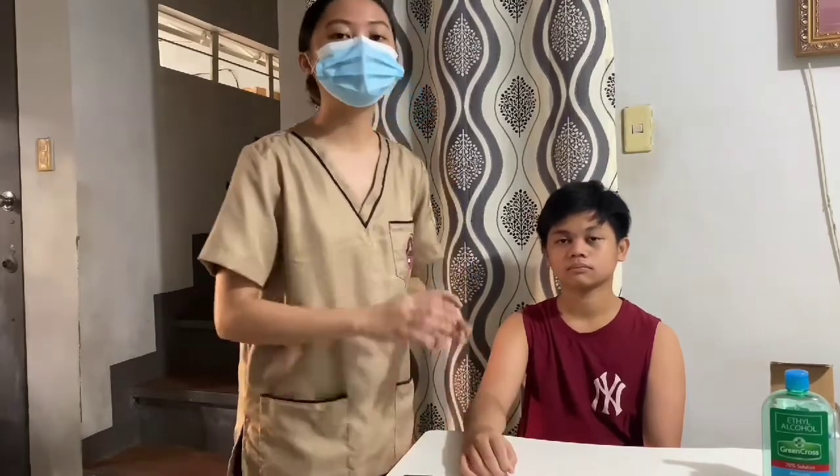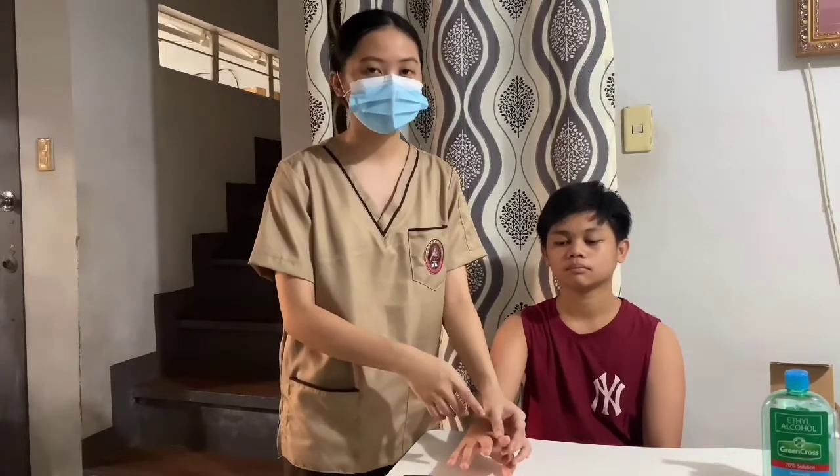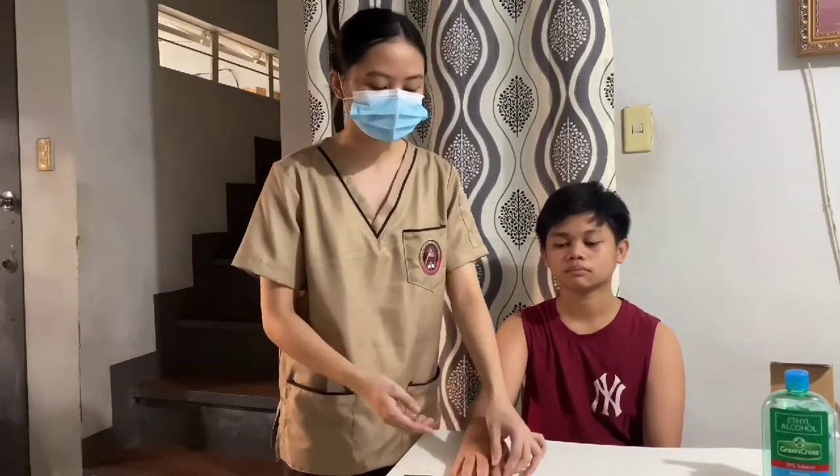And we have to inspect if there is irritation or pressure in the location. And then we have to change the location of an adhesive sensor every 4 hours and every 2 hours for a spring tension sensor. We will now clean the non-disposable pulse oximeter according to the manufacturer's directions and we will perform hand hygiene.